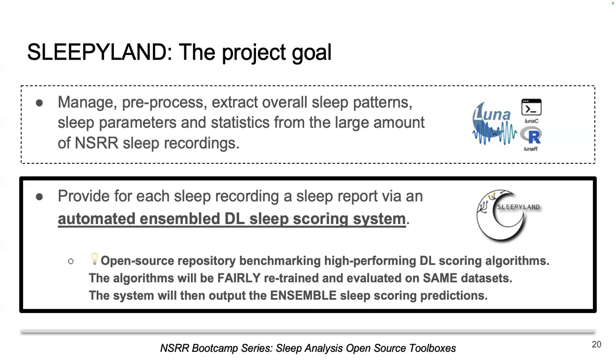So what we are releasing with SLEEPYLAND is this repository to be able to benchmark all the high-performing deep learning-based scoring algorithms. But I have to say one big pro here is that all these algorithms have been, in SLEEPYLAND, retrained and evaluated fairly, because all of them have been retrained and evaluated on the same data sets.